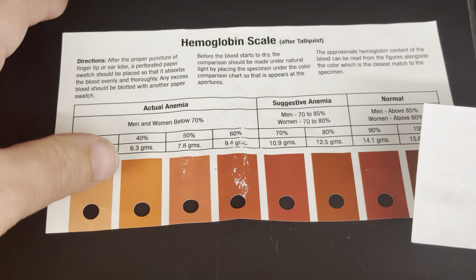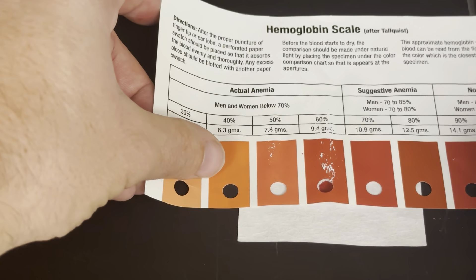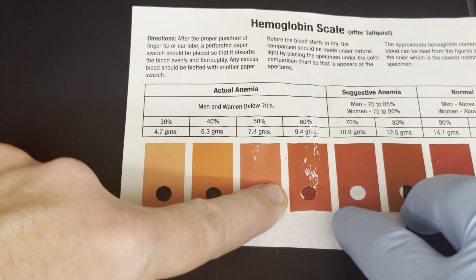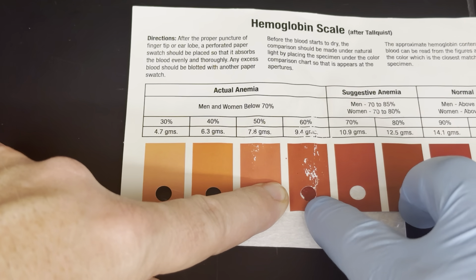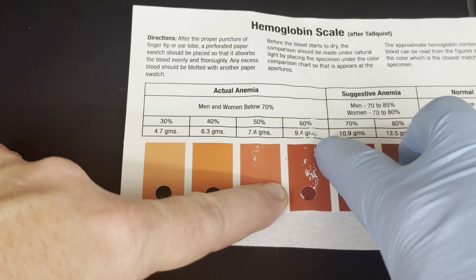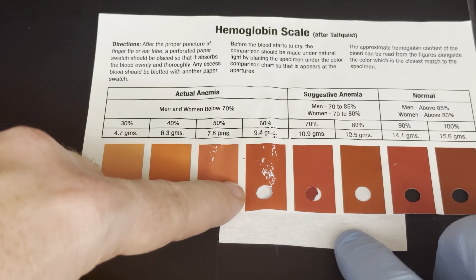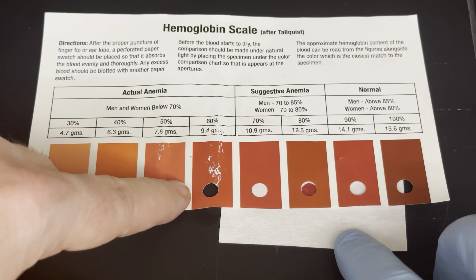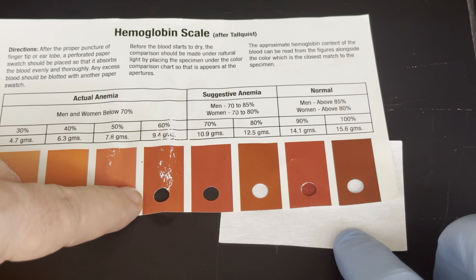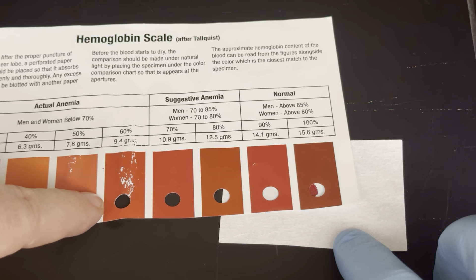You need to read this before it dries, so I'm going to place it on here. What you have to do is match the color of the blood on the Talqvist paper with the color scale, and that will tell you the concentration of hemoglobin. Those two colors don't quite match, that one doesn't either — getting closer — and there, I think that one's just about perfect. But at 15.6, it's not quite there.